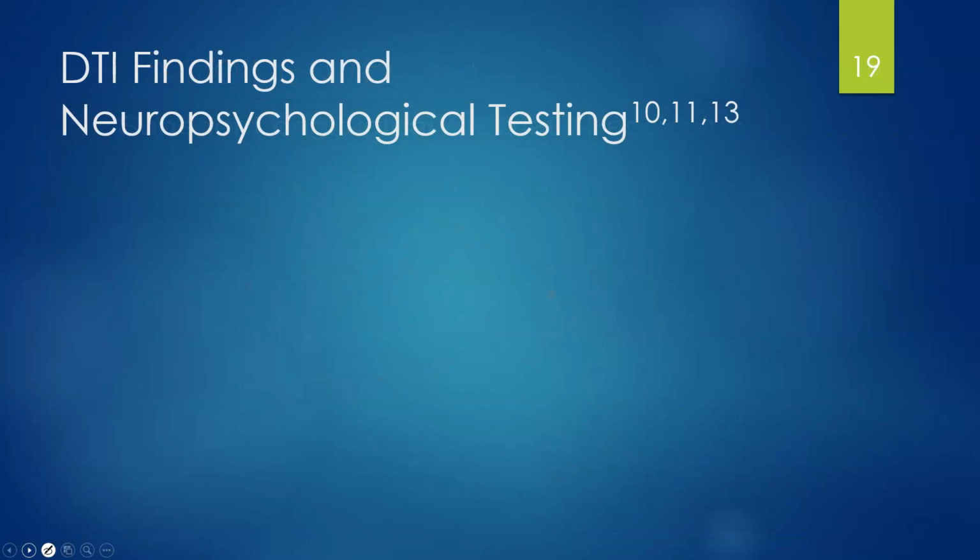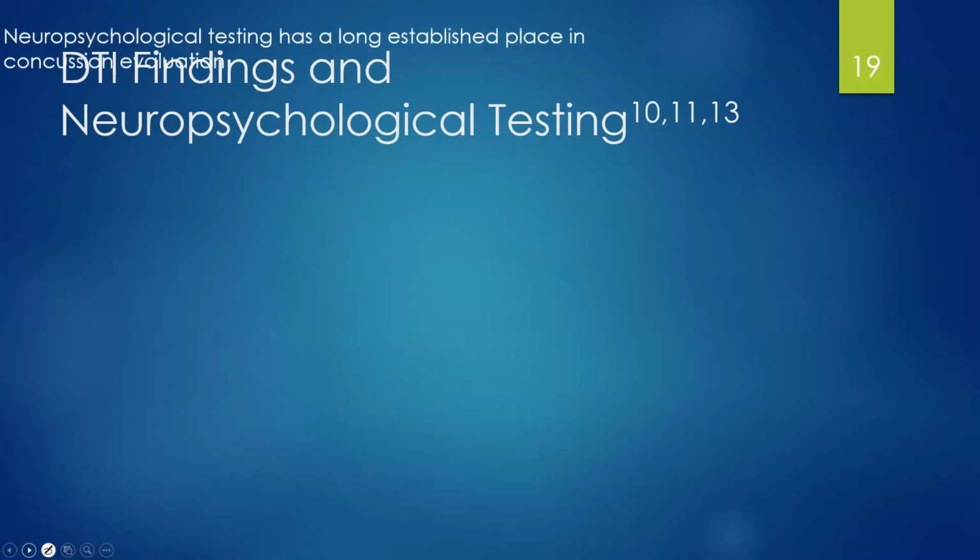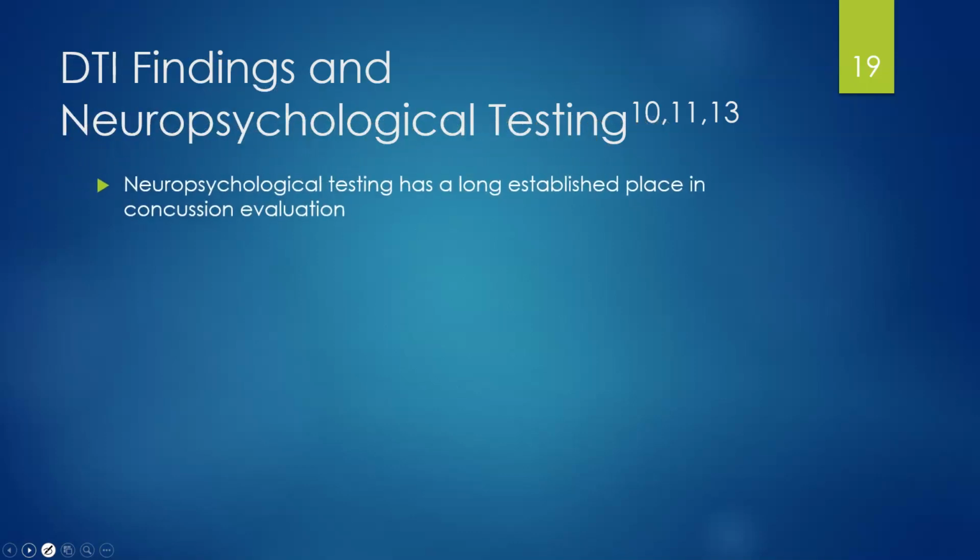Okay, a lot of information to process, but we're getting into the home stretch. So just tying back to all the information that was given, we are going to be taking DTI, and we really still need to connect it to something else. Just like any advanced imaging, we always need to correlate it clinically, and whether it's a musculoskeletal MRI, we need to correlate it to a physical exam.